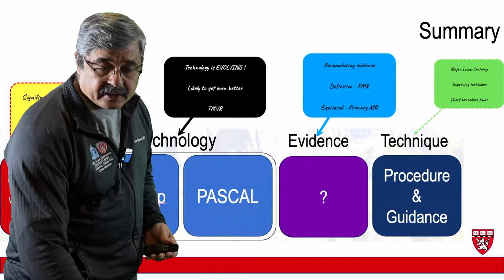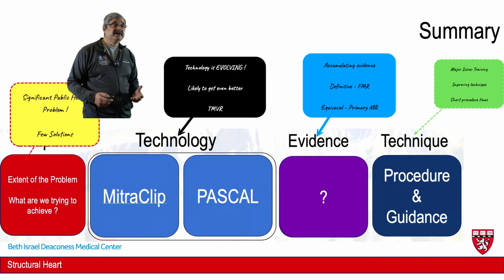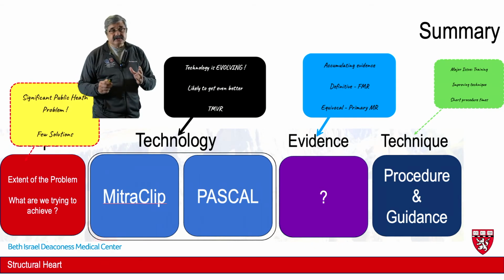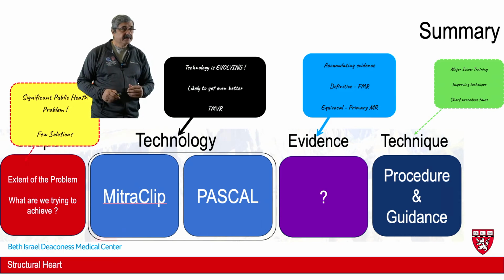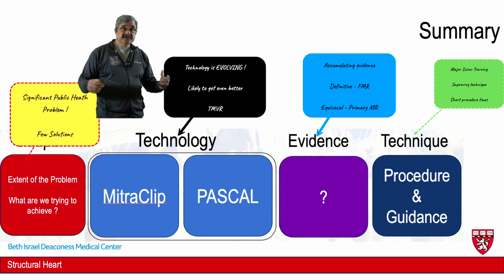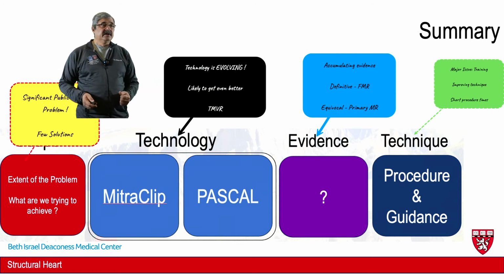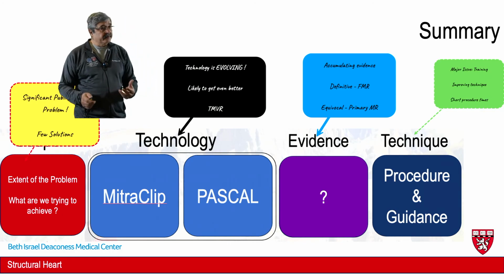At the end of the day, we looked at the extent of the problem: mitral regurgitation, particularly functional mitral regurgitation, is a significant public health problem with very few solutions, and edge-to-edge repair provides a very viable solution as opposed to surgery for these high-risk patients. The technology is evolving. It's likely to get even better over time. The procedure times are reducing. In our place, we do mitral clips in sometimes less than 30 minutes. There are currently 2 players in the market, but likely this number will increase and hopefully will be replaced by even better transcatheter mitral valves. The evidence is accumulating. It is definitive for functional mitral regurgitation. It is equivocal for primary mitral regurgitation.